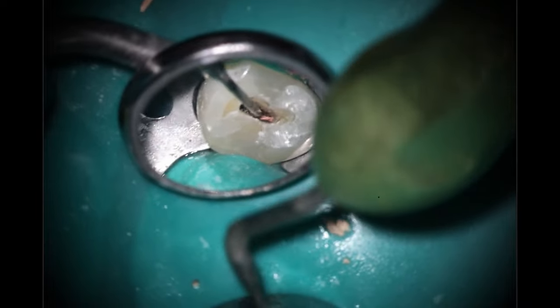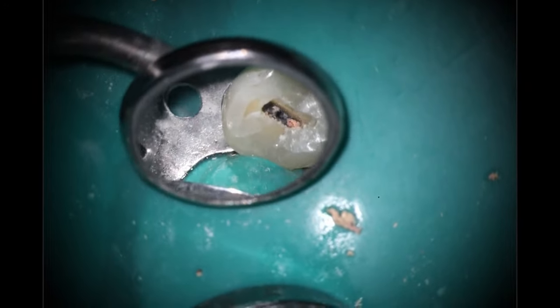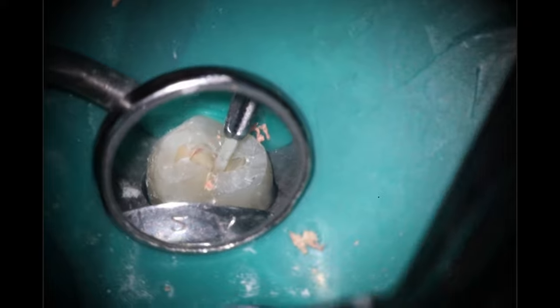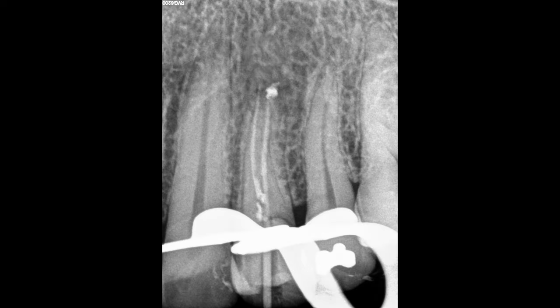Going back in with that plugger, trying to get that nice fill for the palatal. There's still some material in the middle, so this is sped up at three times as I'm finicking to get this as clean as possible inside here. I just don't like having gutta percha in the isthmus — I want to completely encase the post. Going back down the buccal, I'm going to measure to make sure we're at the right length. Putting the post back in, measuring all the way apically — we are right at 13mm, which is where my plugger went to, so I'm very happy with that. Popping that in and taking the x-ray — very happy with that now. It looks good as far as where the post goes to, with a little puff at the end.